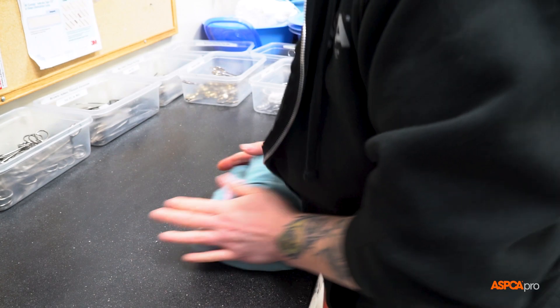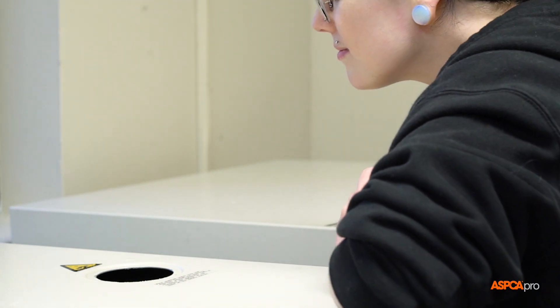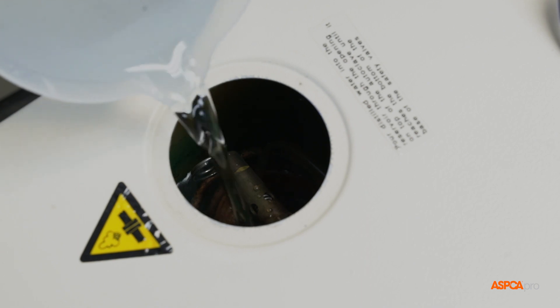Once surgical packs have been prepared, they are ready to be sterilized in the autoclave. First, check that the reservoir contains an adequate amount of distilled water. If needed, fill up through the top opening on the autoclave.